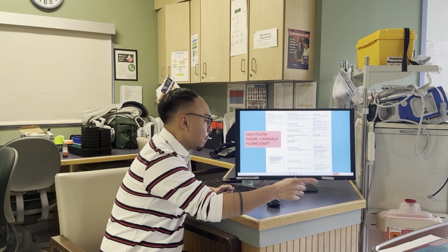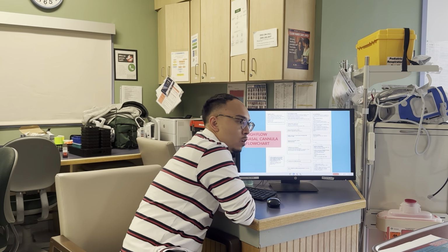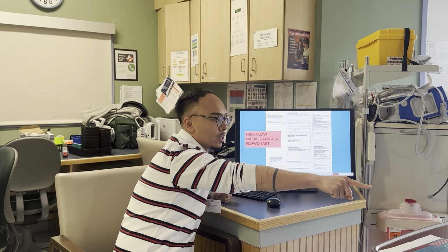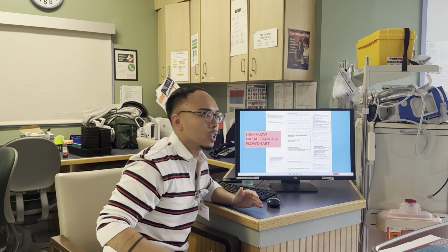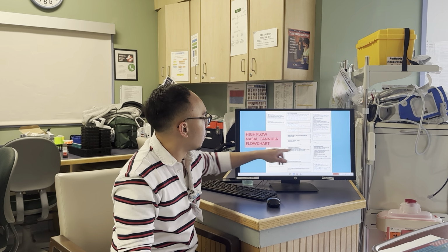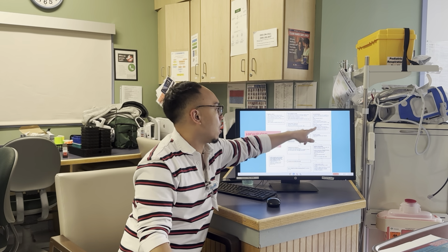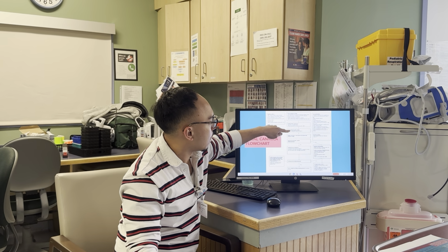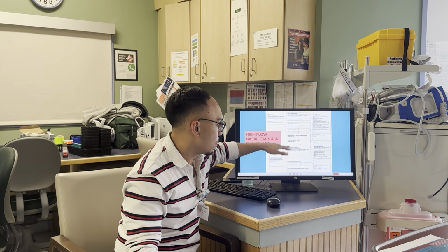So what you have in front of you is a high flow nasal cannula flowchart, again provided by Dr. Kaur. It is evidence-based, and it is primarily dependent on the RSS table, which is on the bottom of that. So we'll go over that in detail, about how to score a patient and give them an RSS score. But for the most part, this flowchart on the left shows the eligibility criteria, on the right shows the contraindications, and in the center is the timeline to which we're treating this patient and what we're doing, what we're charting, what we're monitoring.